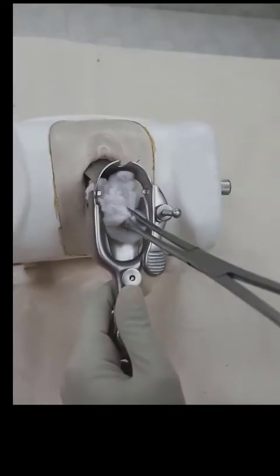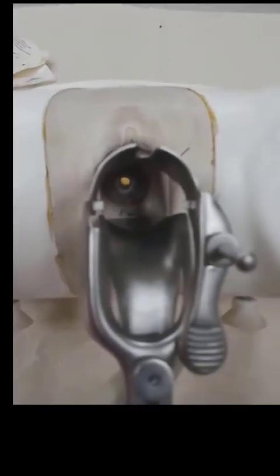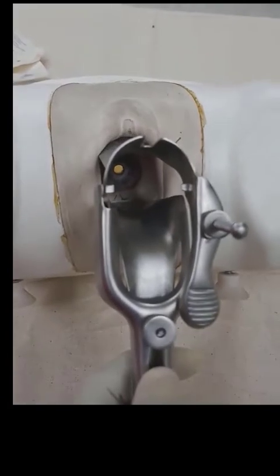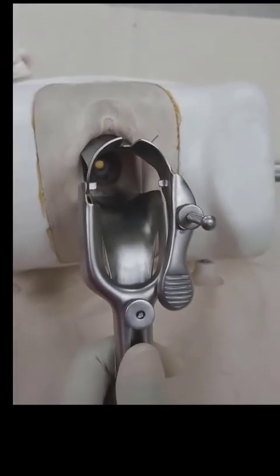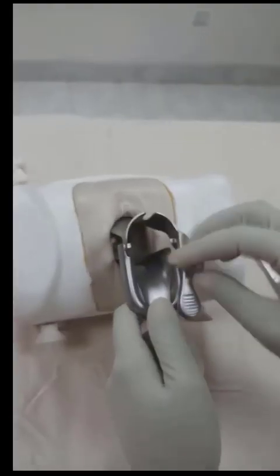After one minute the cotton swab is removed and the cervix is visualized for any whitening. Look that there is whitening around the squamo-columnar junction. So this is VIA positive.